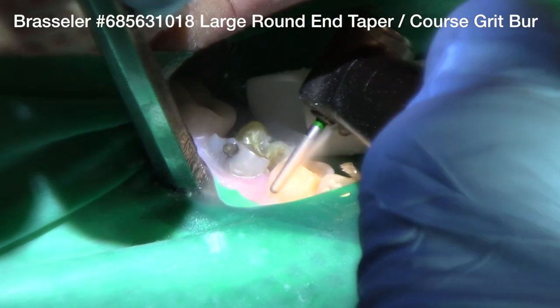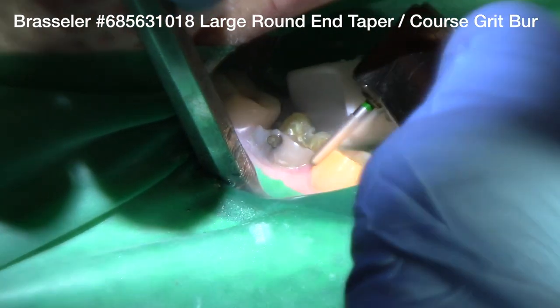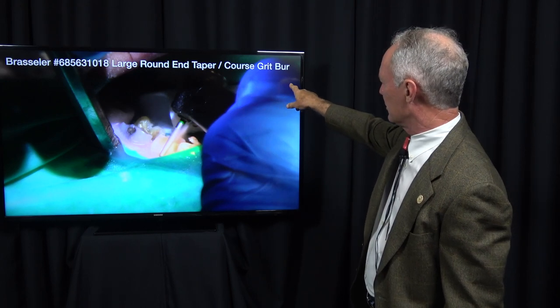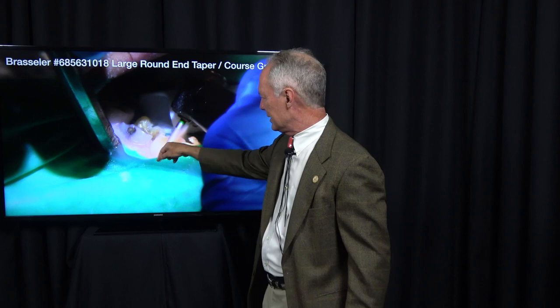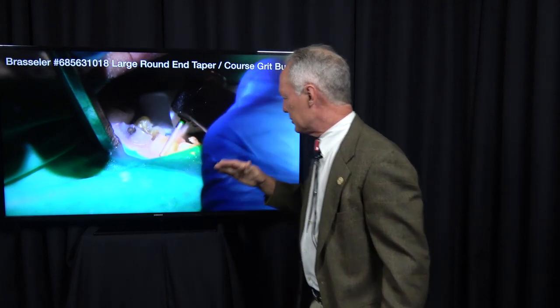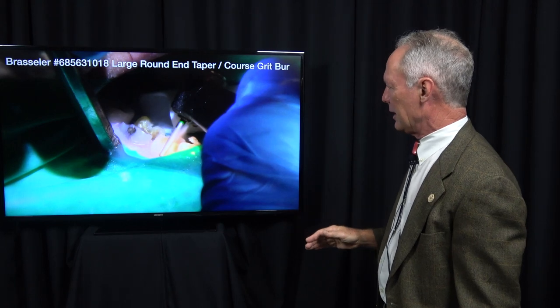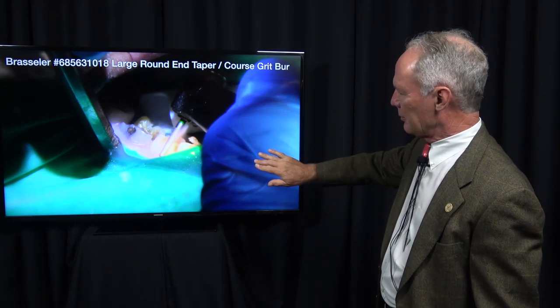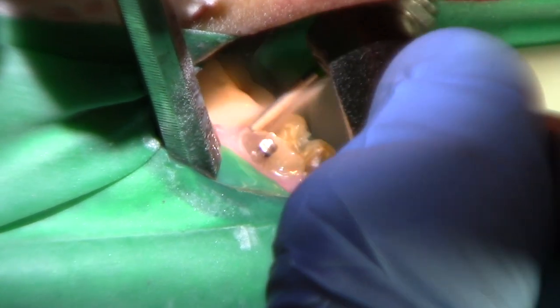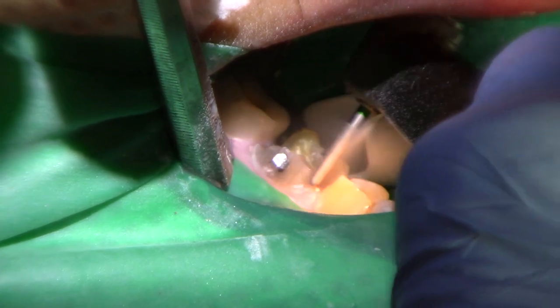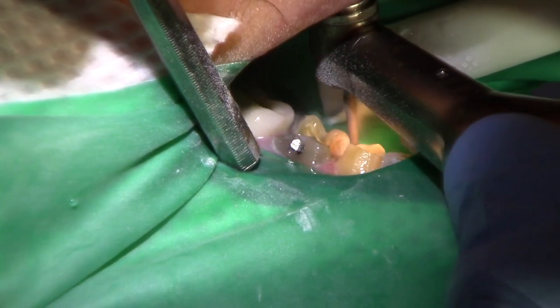This is the initial part of the preparation with the large, round-ended, tapered, coarse grit burr. It's a round-ended diamond, and I'm prepping just supragingivally with that burr. I want about a millimeter of preparation depth. Preserve all the tooth structure that you can, but be sure you have adequate reduction for your restoration.